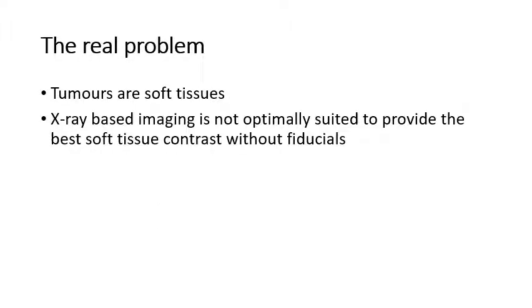However, even with good imaging technology, the radiotherapy beam positioning problem is challenging because tumor tissues are soft tissues, which are similar to healthy tissues, and difficult to visualize using X-rays.